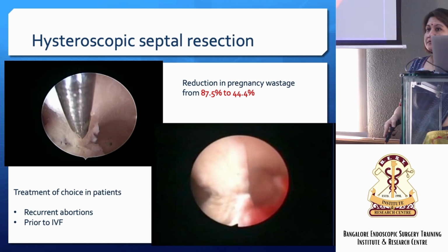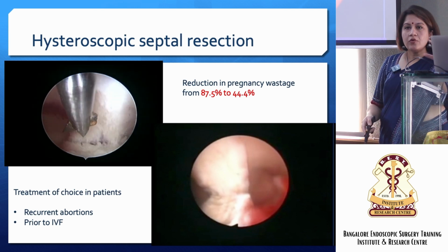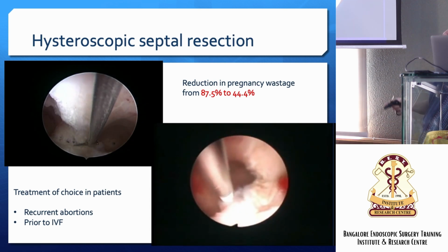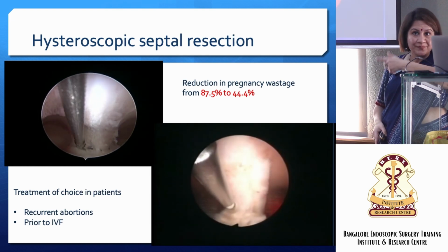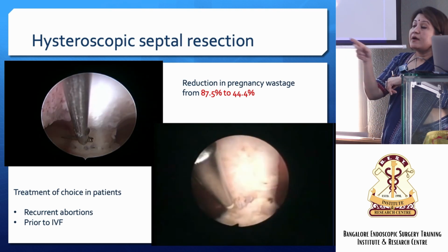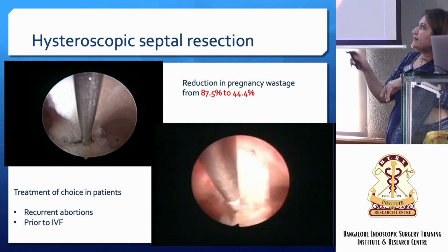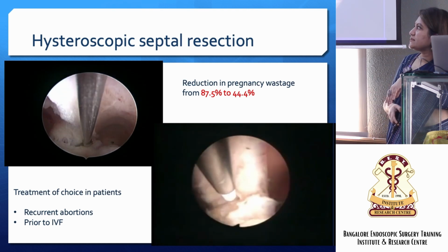Okay, so this is the Bertuzzi hysteroscope. As I said, most surgeries can be done with it. I don't know where I got this video, because obviously I don't do this, I must have used somebody else's video. This is the needle that comes with the Bertuzzi. Otherwise people use a Collins knife, which has the same principle, you know, left to right you skip. The speed of a Collins knife with cautery is obviously much faster than a scissor. You just keep going like this and will finish very fast. The scissor is slightly slower, but in the time you take to arrange the whole setup, you would have finished the septal resection with the scissor.